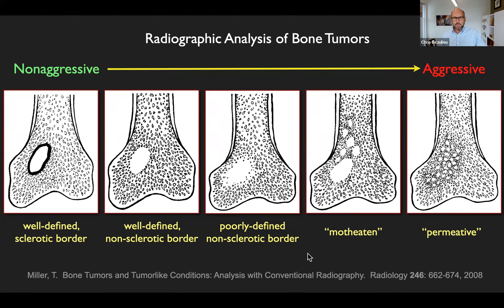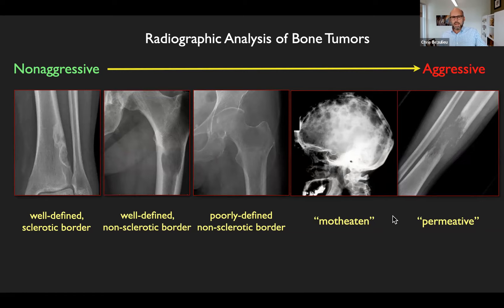Here are some radiographic examples: non-aggressive with well-defined sclerotic border, well-defined without that border, less well-defined, multifocal or moth-eaten, and permeative — just eating away the bone, where there's really no question it's an aggressive malignancy. This particular patient with multifocal calvarial lesions: you could think about metastatic disease or myeloma. This was a patient with metastatic lung cancer with extensive bone metastases.